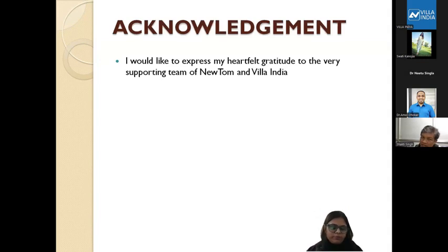Okay, so this was the end of my presentation. I would like to express my heartfelt gratitude to the very supportive team of Newtom and Villa India. Newtom has created the first dental CBCT machine, as we all know, and we are relying on that in our routine dental practice nowadays. It will be good if we do CBCT scans before our clinical cases, because it helps a lot in diagnosing as well as in deciding the treatment plans for the patients. Okay. Thank you.